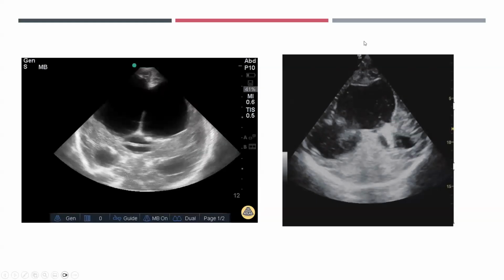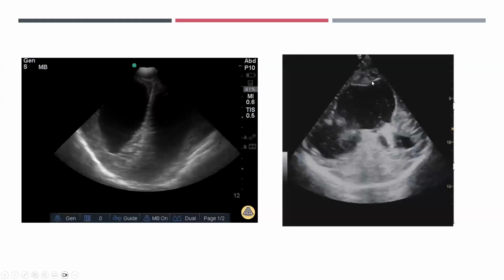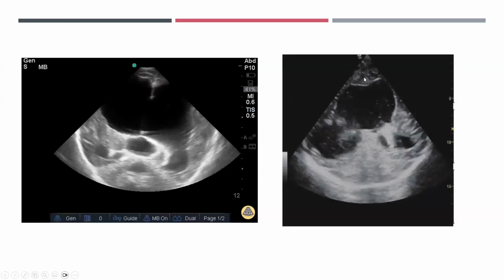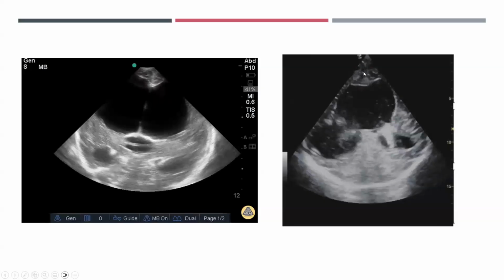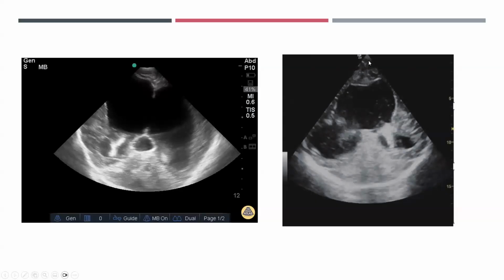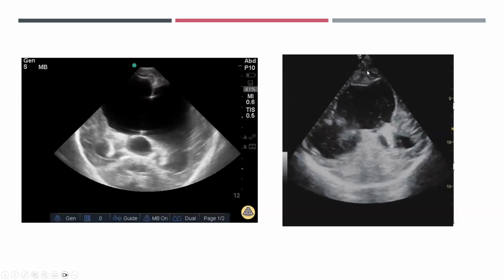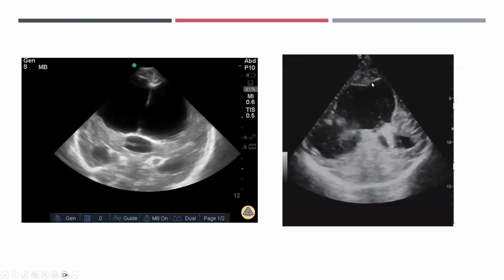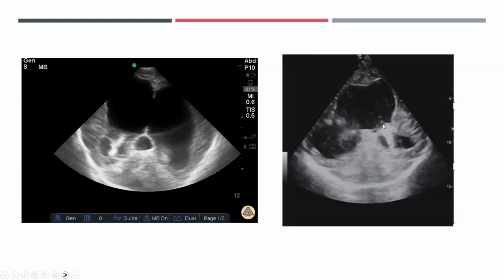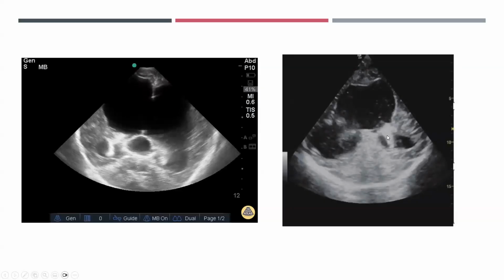So this phenomenon of the ultrasound probe sending sound waves through tissue, and the energy that is absorbed by the tissue, causes the sound waves to become attenuated or weaker. And then when they're weaker, they'll reflect back less, and that will give you images that are darker. If they go through fluid, there's less attenuation. So they hit bright areas over here with a higher velocity, and that gives you brightness.